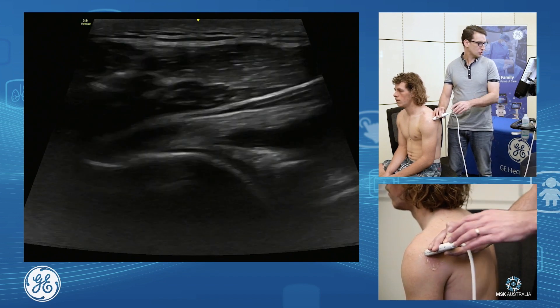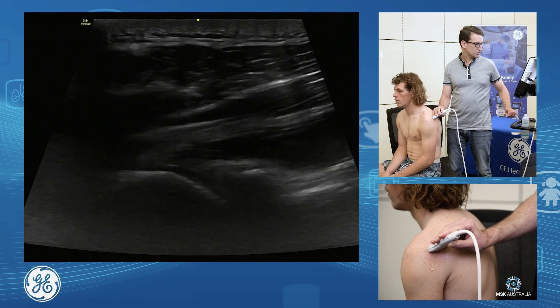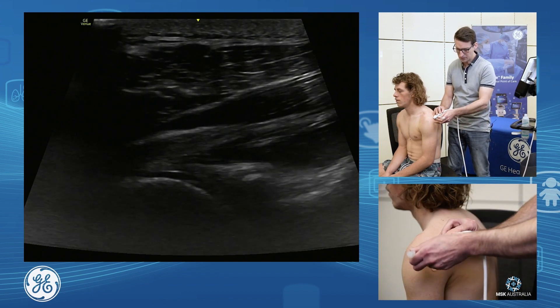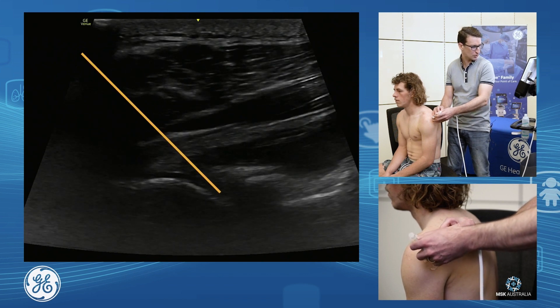The way we inject is we move and have our joint in the middle. We come in from our lateral approach after we've sterilized the skin and just drop down next to it, dropping down and into the joint capsule from this side.